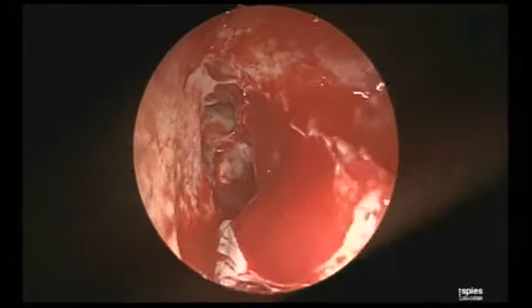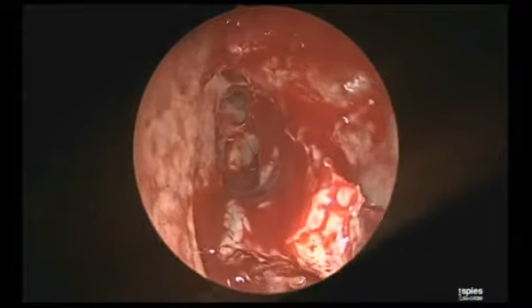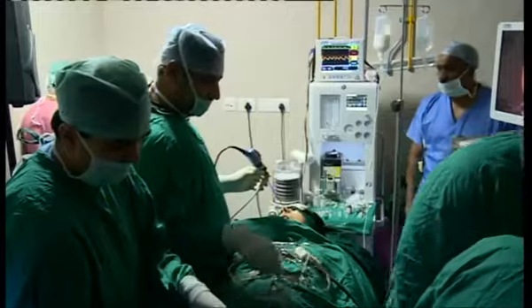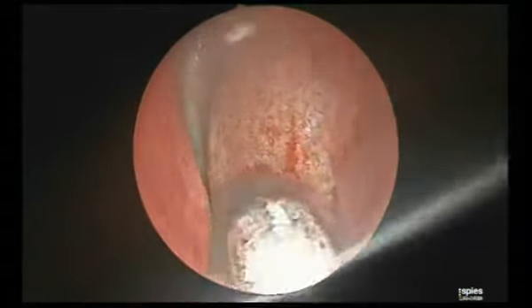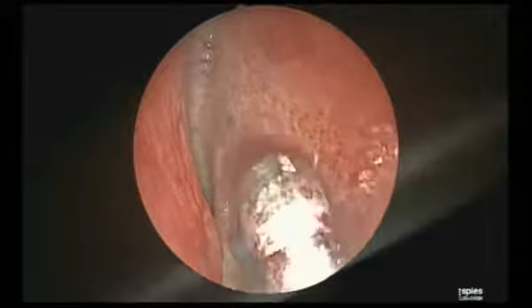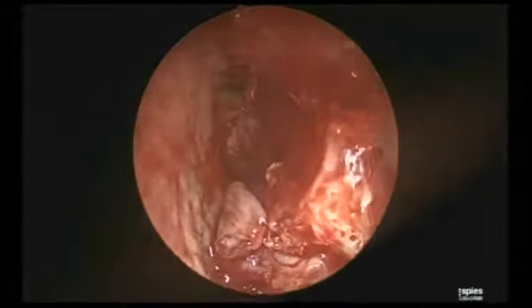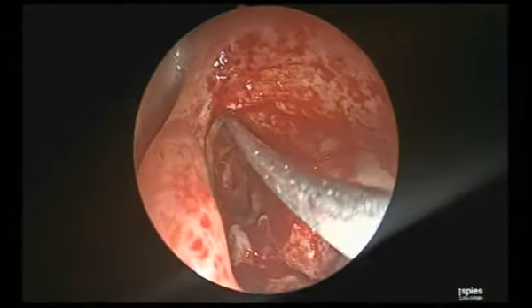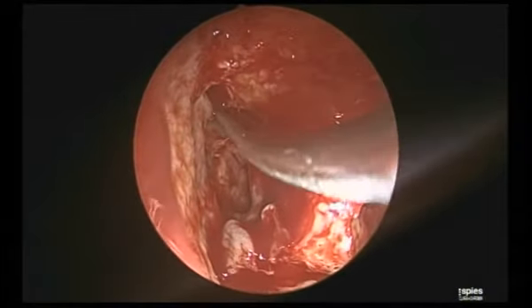What I am trying to show is, see now the longer probe. See the beak we have seen on CT scan. We know this beak forms the floor of the frontal. At the same time, it forms the anterior wall as well. The frontal is behind this. So if you follow the beak, where is it going to end? See this thick beak. If I follow it, where is it going to end?